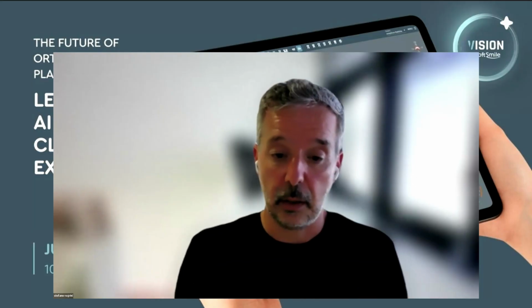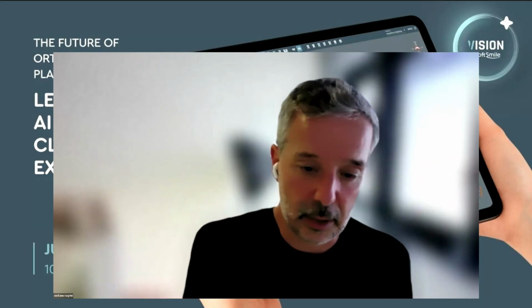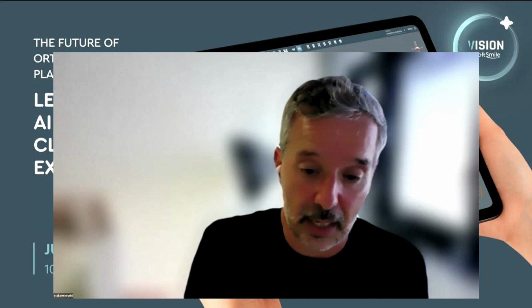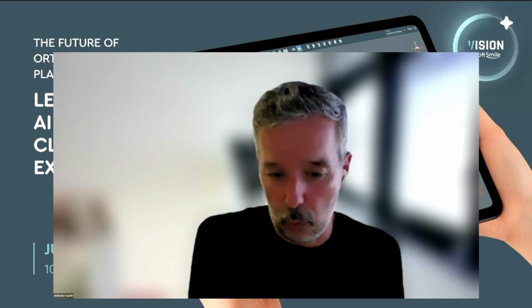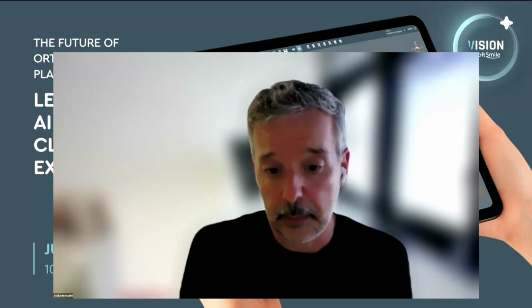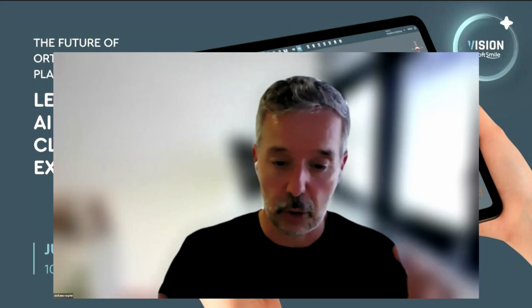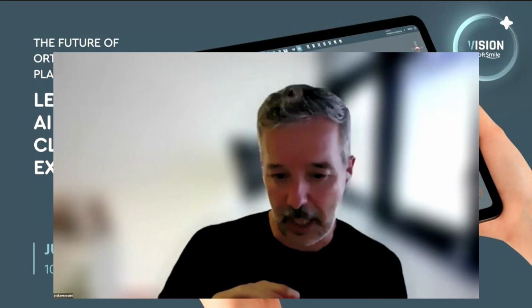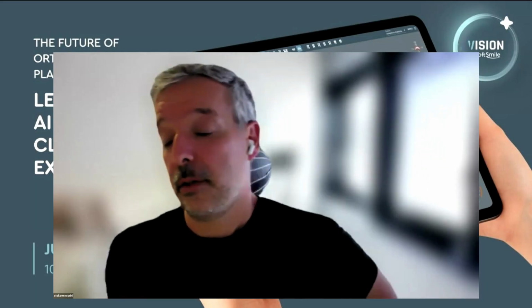add the attachment just at the end of the distalization. Obviously, adding the attachment during the treatment is not as easy as when you put all the attachments at the beginning, because you need to pay attention to that. But it's possible to switch attachments, not put all of the attachments at the same time. That's it. Yes, of course.